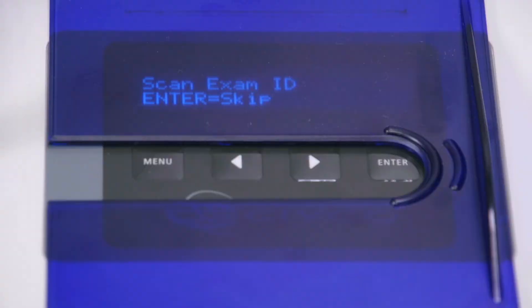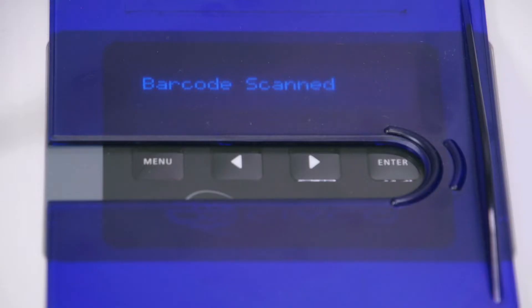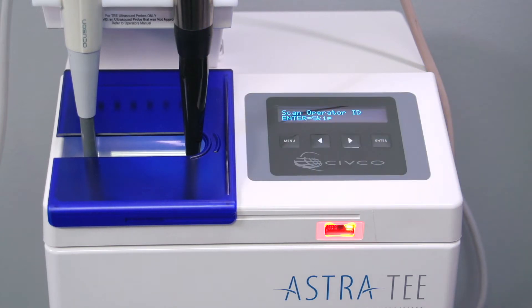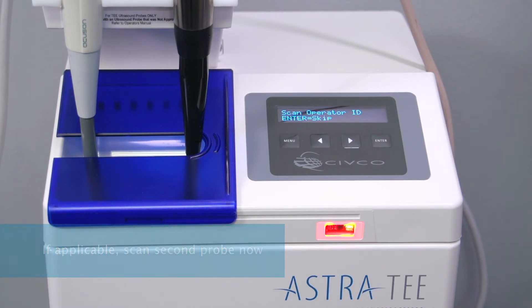The glove that held the probe shaft should now be removed as it may be contaminated. The display now reads 'Scan Exam ID' — this is the accession number or other identifier. The display then reads 'Close Door or Scan Second Probe.' If doing a single probe, simply close the door. If doing a second probe, put on a fresh glove, scan the second probe, and follow the prompts.